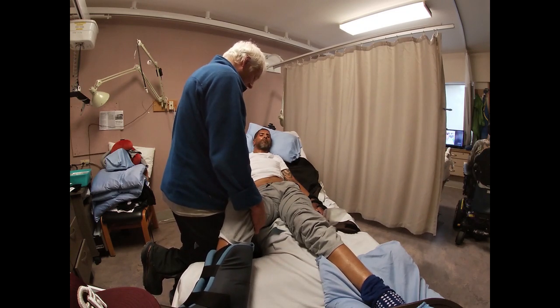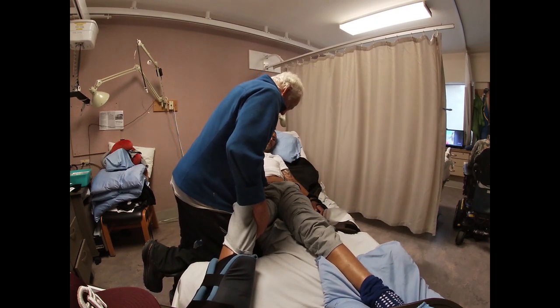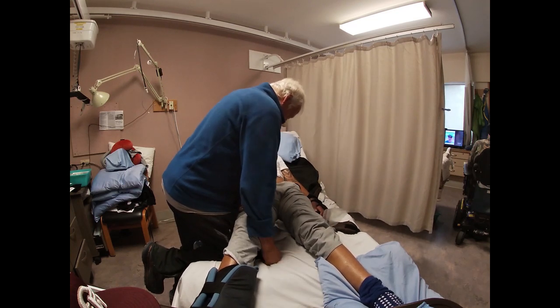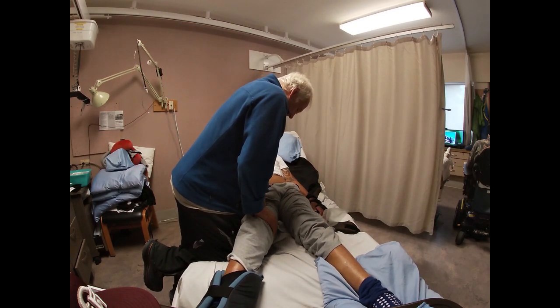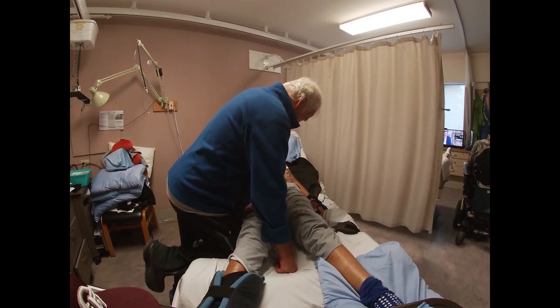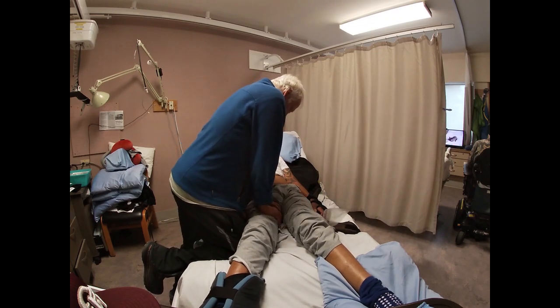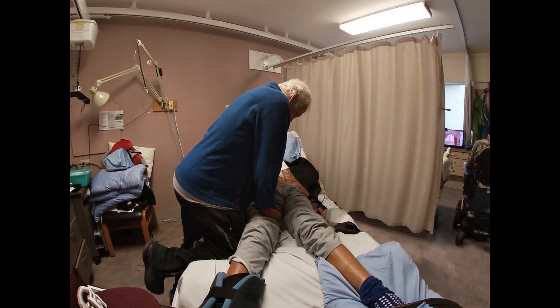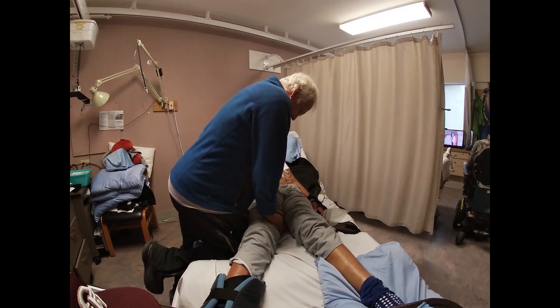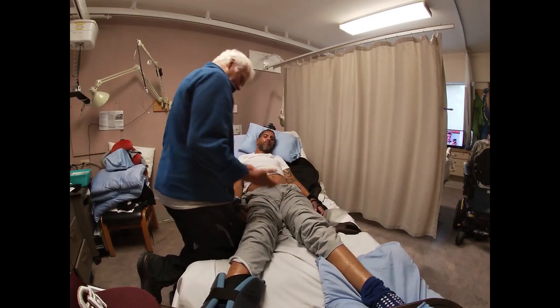Okay, can you move that kneecap there on that side? We push down. Yeah, that's good. And can you push down and roll? Well, it's hard to do when the nerves are injured, and it's harder to do when the body has become weak. Pushing down's easy. But pulling up, I think it's yeah. That's where you got to use the legs and the hands.